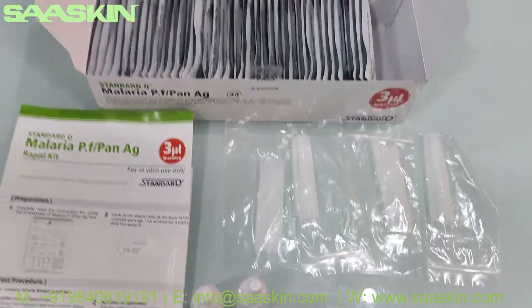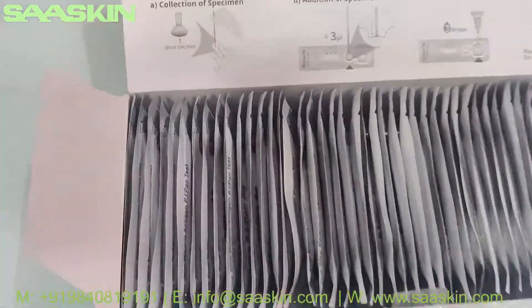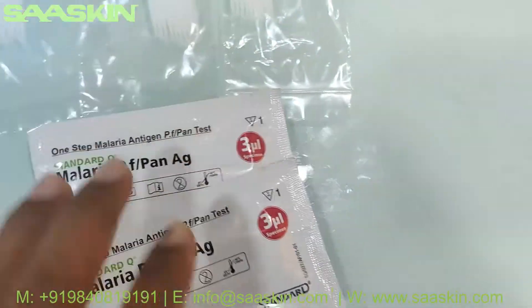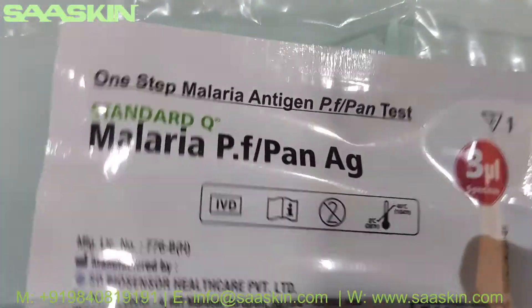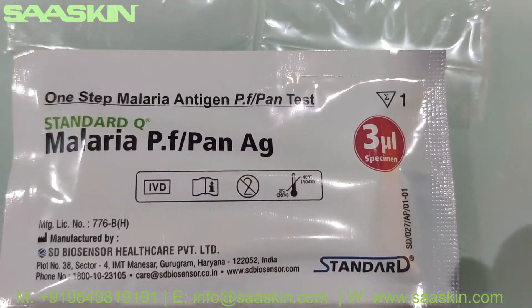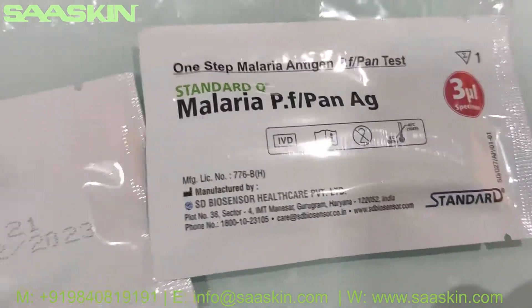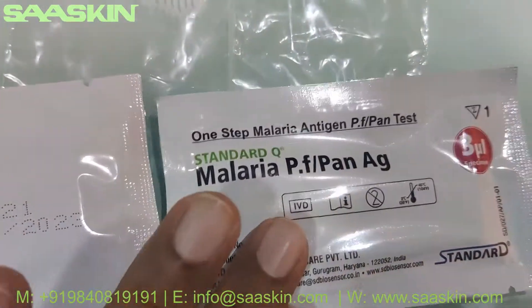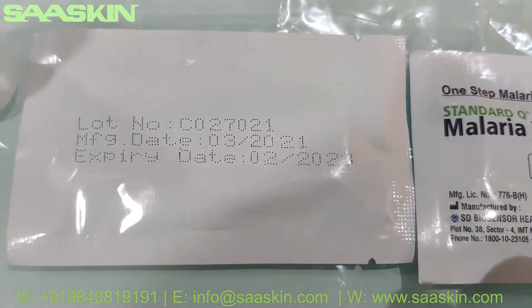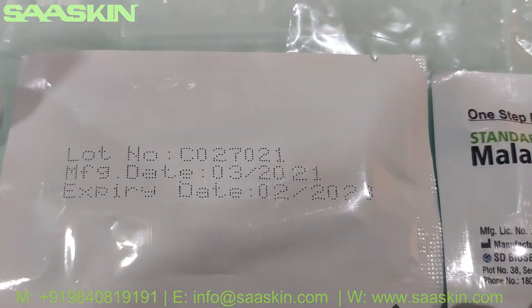Then you have the 40 test cassettes. You can see the cassettes here — the Standard Q expires in 2 years.